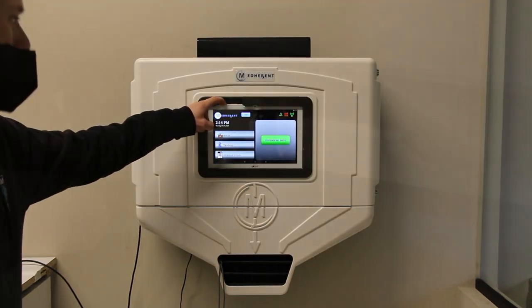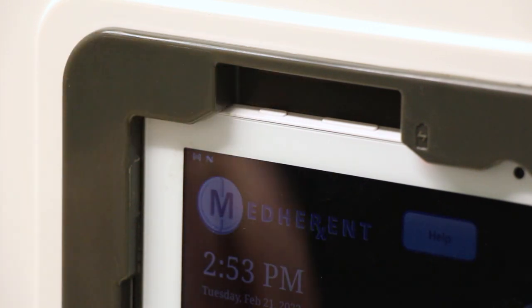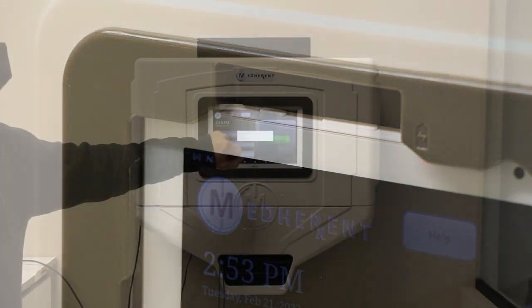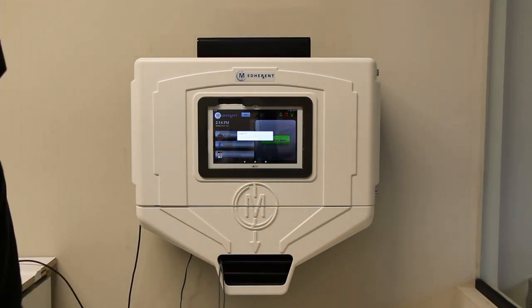This is the power button for the screen that effectively controls the MedHerent device. Please make sure that you hold the power button down until a pop-up appears on the screen that gives two options: power off or restart. To power off the device, tap Power Off on the pop-up message to confirm that you do in fact want to turn the screen off.